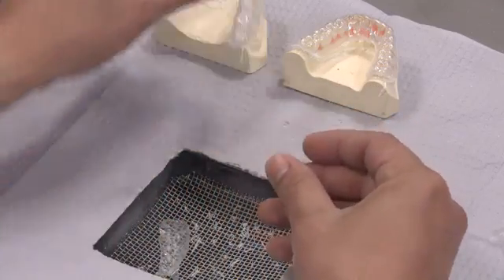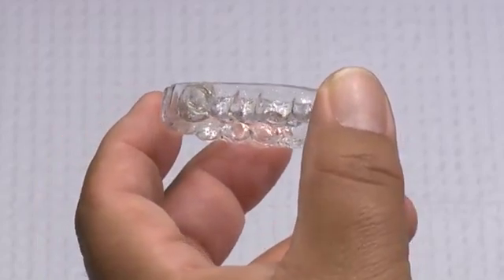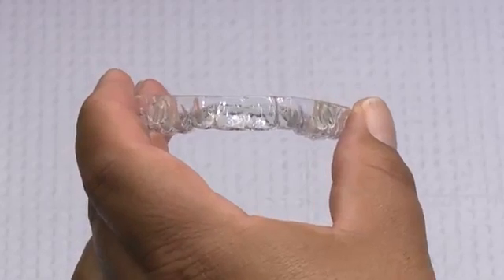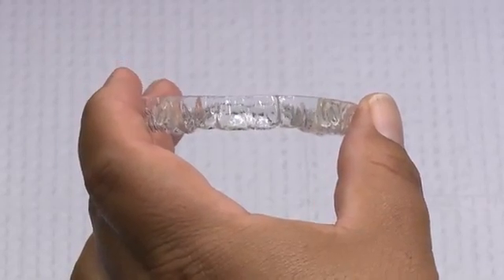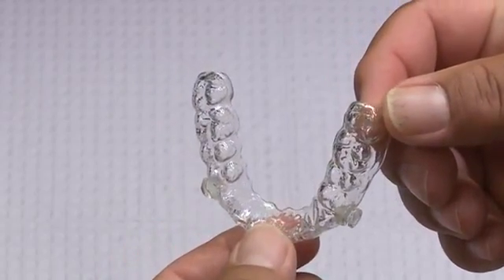The finished lines for the upper should appear as follows. Posterior buccal, approximately 1 to 3 mm from the gingival. Anterior facial, at the gingival line. Lingual, approximately 1 mm scalloped from the gingival.